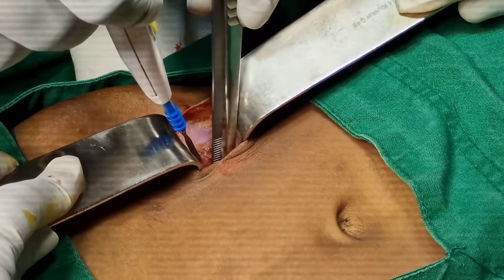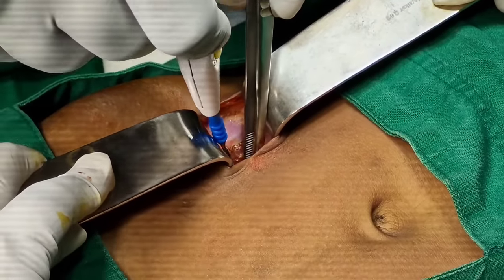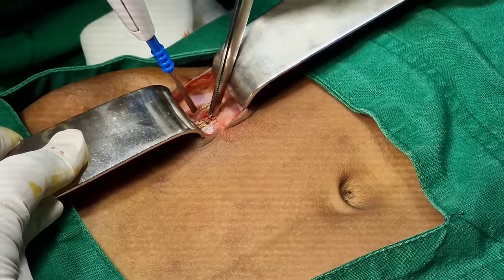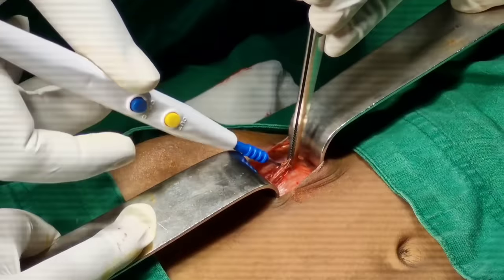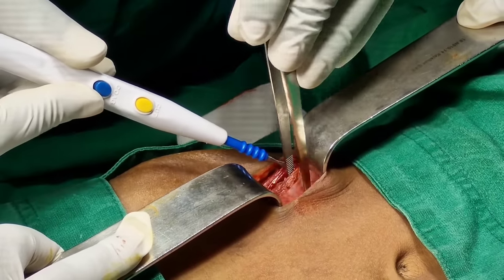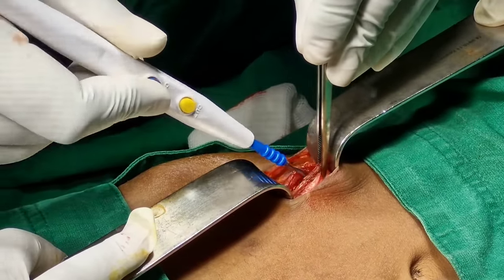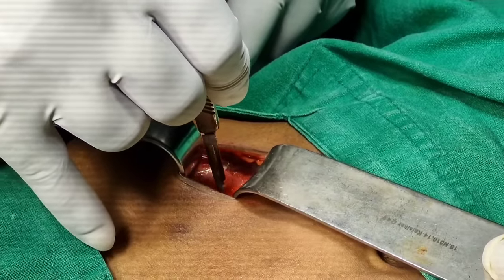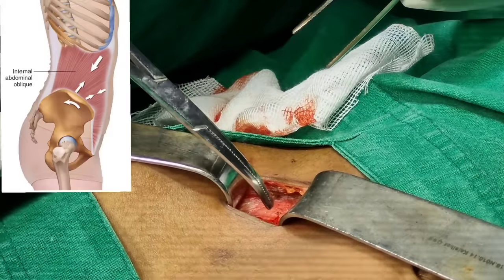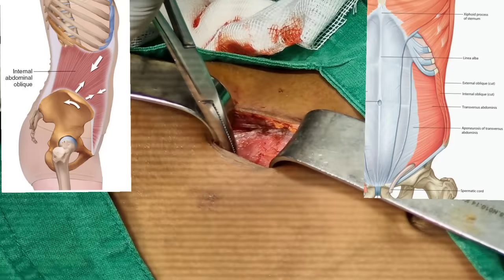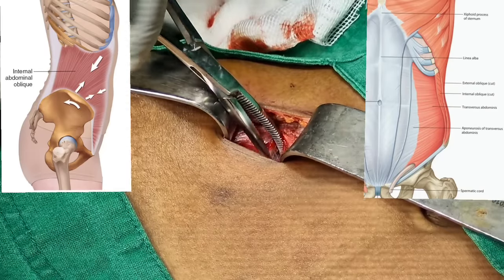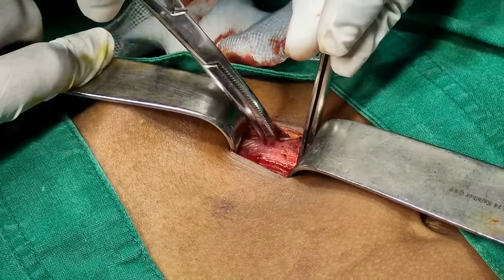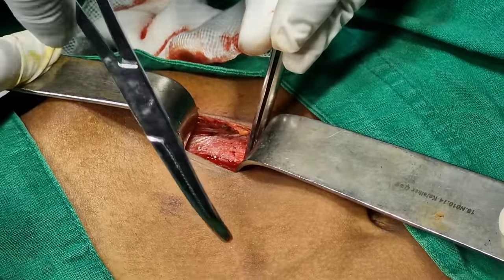Observe how the surgeon is using forceps and cautery. Always do careful dissection while opening so that it will be easy during closure. Then, advance the C retractor. Below the external oblique, you will see internal oblique and transversus abdominis muscle. Split it in the direction of muscle fibers. See how artery forceps is being used to split the muscle.